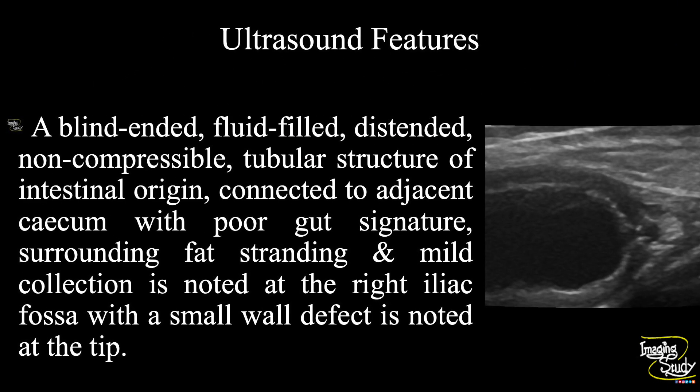In summary, a blind-ended, fluid-filled, distended, non-compressible tubular structure of intestinal origin connected to the adjacent cecum with poor gut signature, surrounding fat stranding, and mild collection is noted at the right iliac fossa, with a small wall defect at the tip of the lesion, suggesting a case of gangrenous appendicitis with perforation.